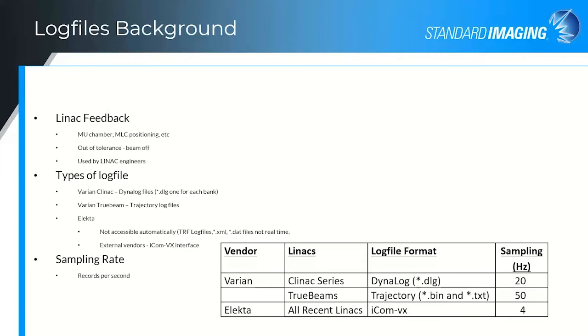The Elekta log files are a bit more complex. For real-time access, we are required to use the ICOM-VX interface, and then we generate our own log files from this ICOM-VX interface. This interface is suggested for use for all third-party vendors.